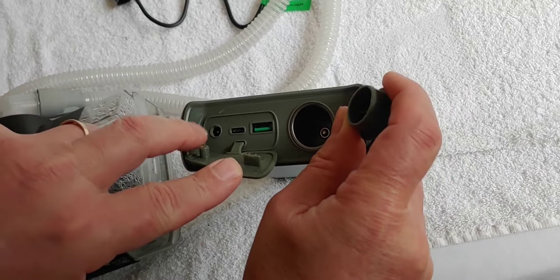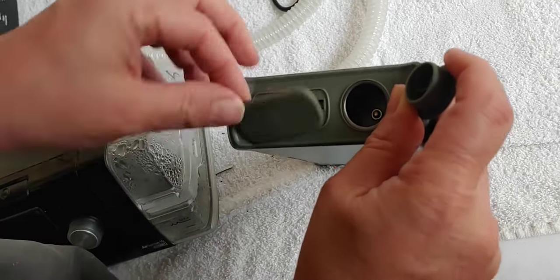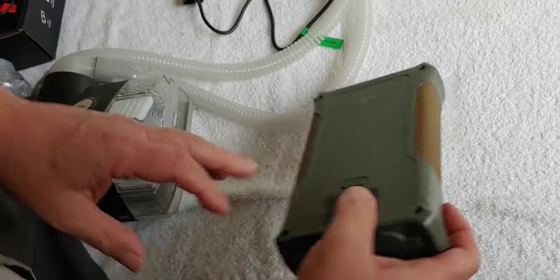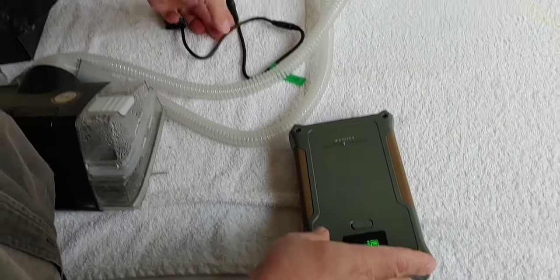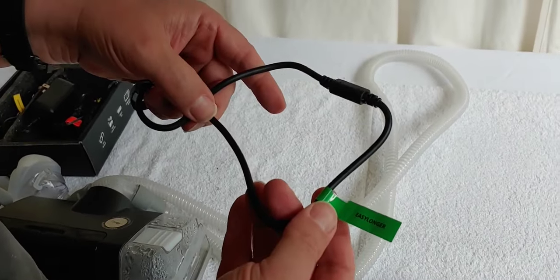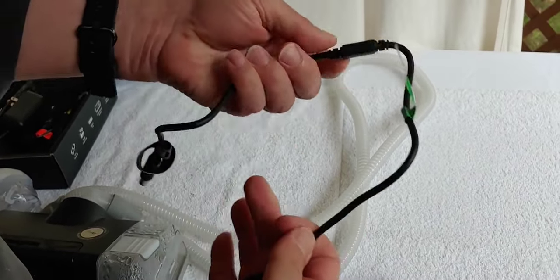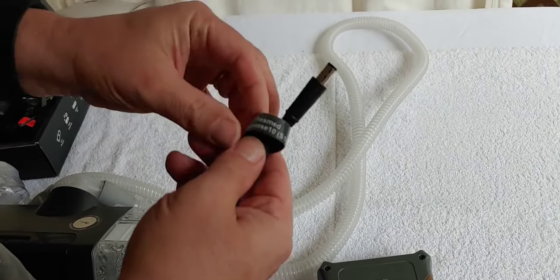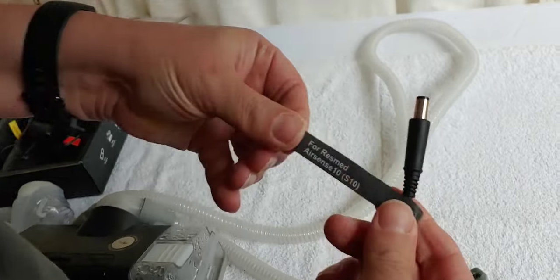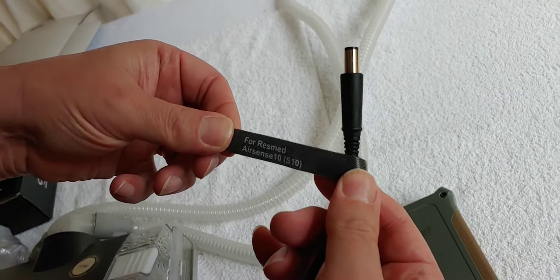We're going to be using the DC in and out connection right there. As you saw when I opened it up, they have cords that come with it that tell you which one will actually work with your device. Since we have the ResMed AirSense 10, that's the cord I'm going to be using.